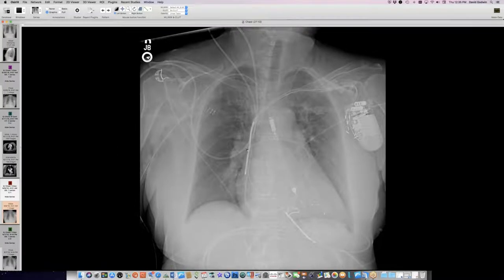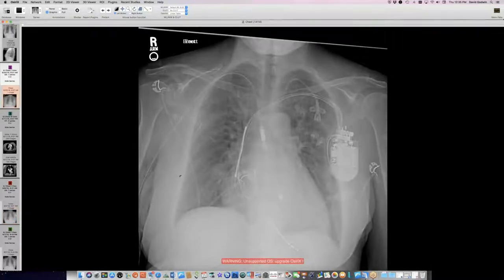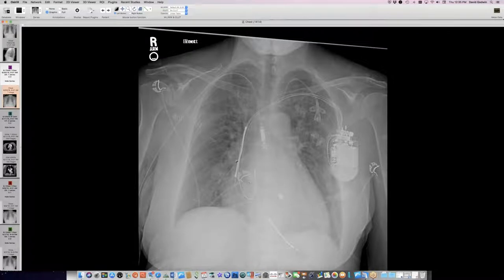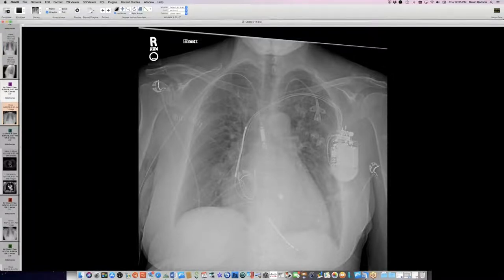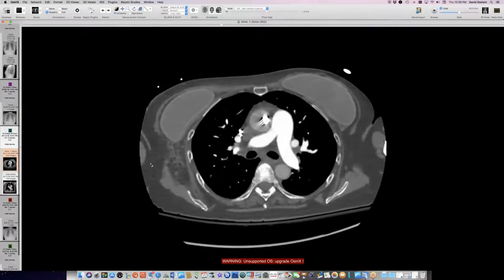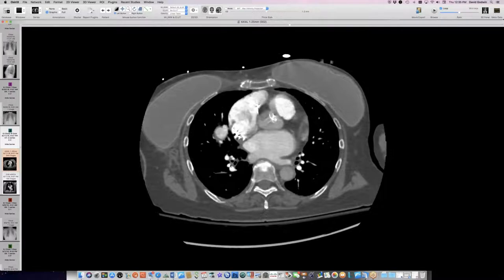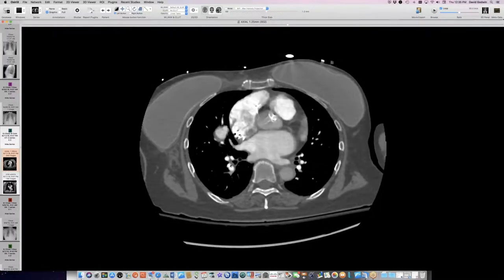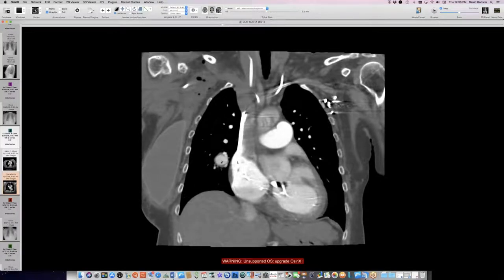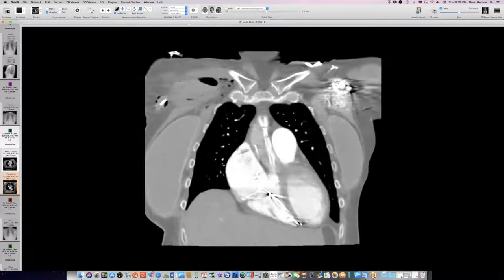At this point we have a catheter at the right hilum — in the old days this would have been considered perfectly normal placement. Then a while later, a lesion has now emerged in the right lung — several days after that. An Impella has been placed for her severe heart failure. This person has a persisting lesion that shows up very nicely as a pulmonary artery pseudoaneurysm — presumably catheter-induced from that Swan-Ganz catheter. We never saw the catheter get this far peripheral, but it might have transiently.